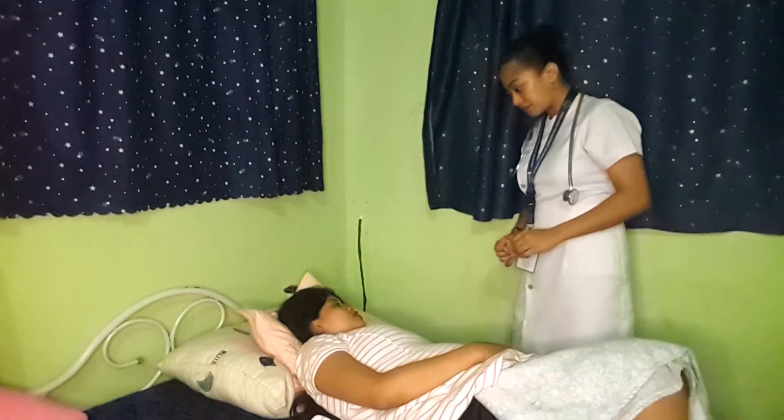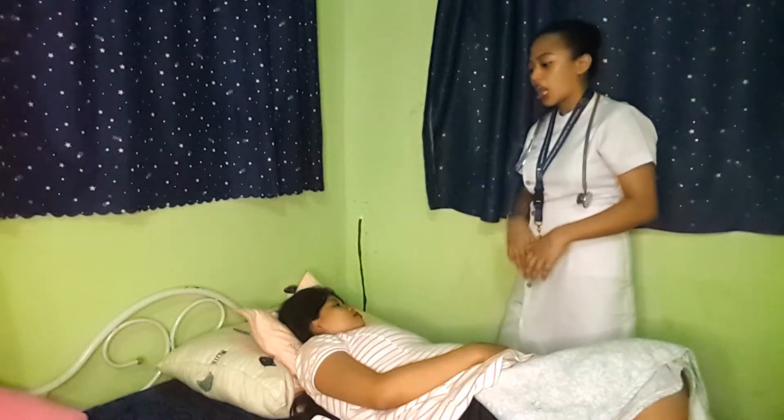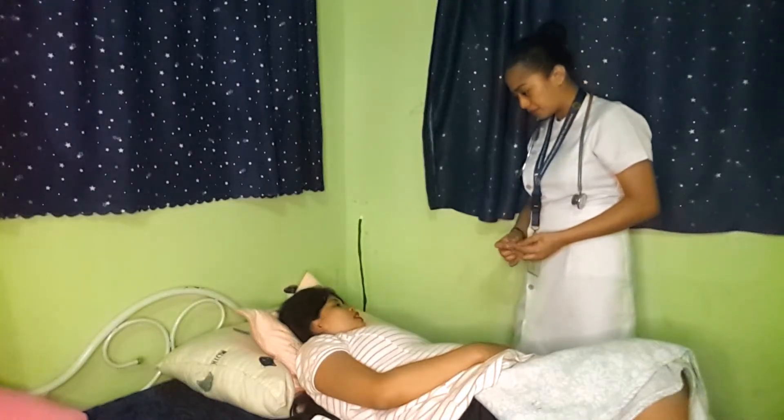Are you ma'am Colliado? Yes. Today we will be having a fundal height measurement. It will not hurt you as well as your baby, and it will just take a short period of time. Is it okay for you? Yeah.